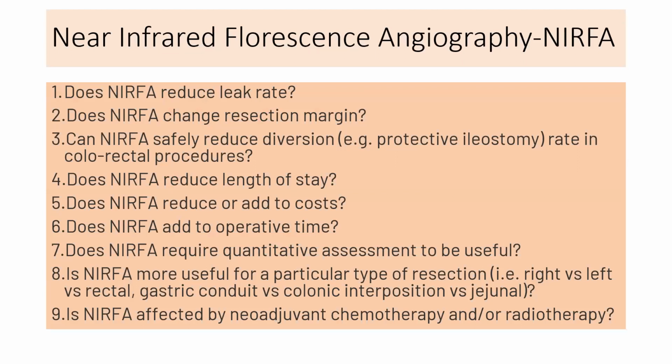So why are we using this particular infrared imaging by the ICG technique? It will reduce the leak rate, it can change the resection margin, and it can also reduce the diversion rate in colonic malignancies. Then it can reduce the length of stay, obviously, if the leak rate is decreasing. It will not add much cost for the patient. Only the hardware is costly, one time; otherwise the dye is very cheap, and it is also time saving in the surgery.